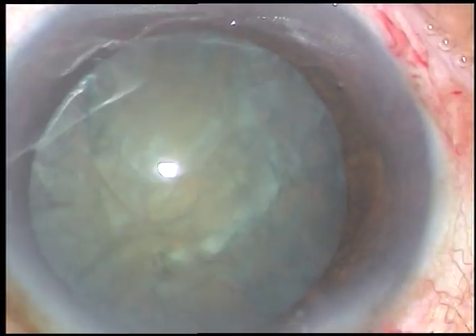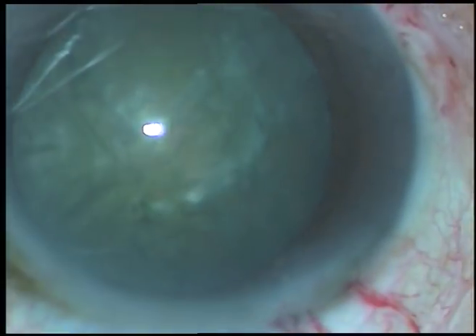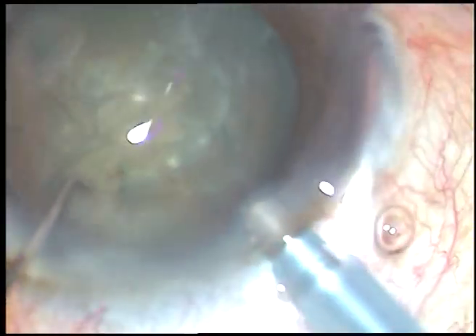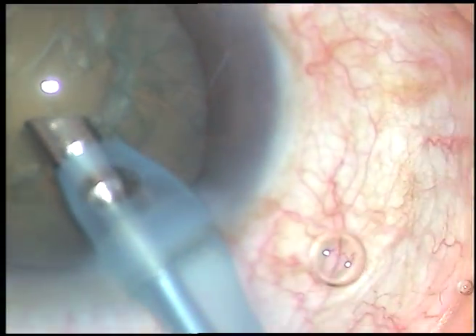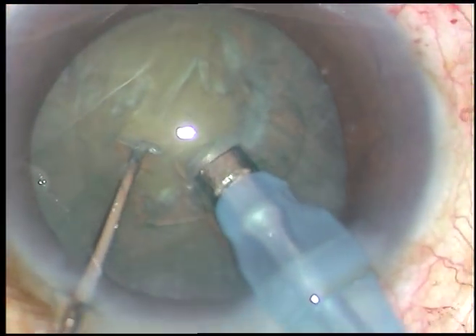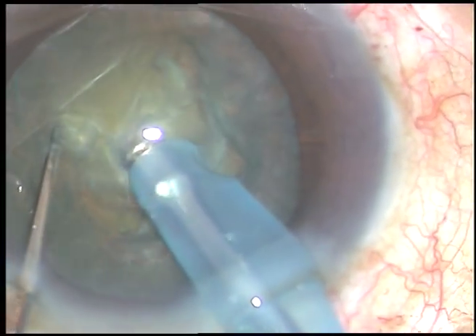Then viscoelastic substance is injected. The viscoelastic substance being used is 2% HPMC. And now, the tip of the phacoemulsification is introduced. I usually do direct chop — I usually don't make any trench.